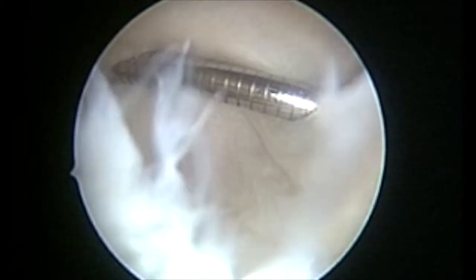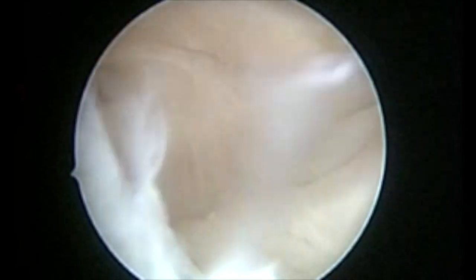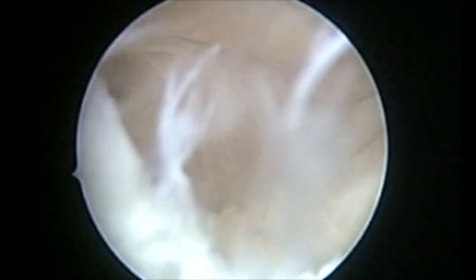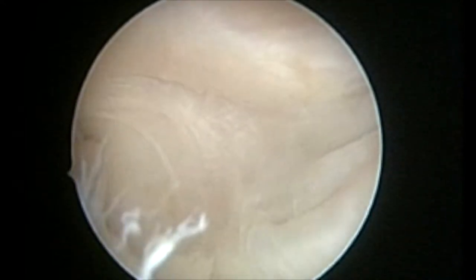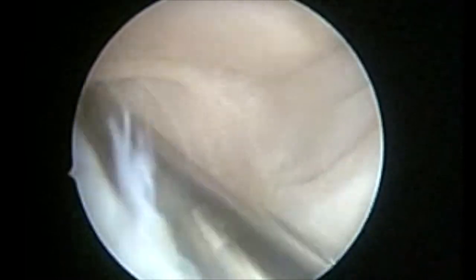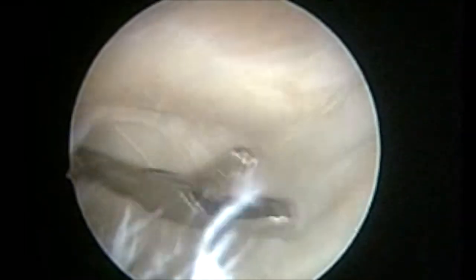The next step in the management of Baker's cyst is to enlarge the one-way opening of the capsule and make it a larger opening so that there is bidirectional flow of synovial fluid. Another hypothesis put forth is that healing of a large opening in due course will take care of recurrence.